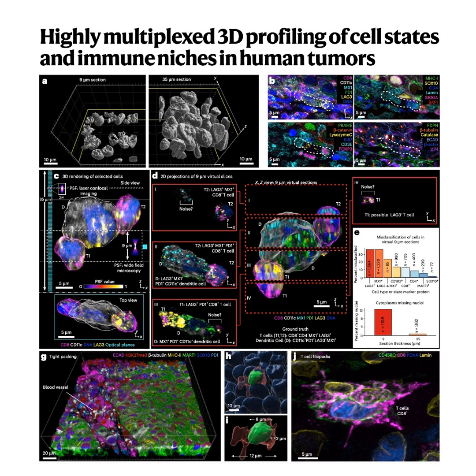70 nanometers, let's put that in perspective again. A human hair is maybe 70,000 nanometers. The old thin slices were 5,000 nanometers. We're talking incredibly close. Exactly. Nanoscale precision. And that 70 nanometer spacing is biologically significant. It's the precise distance consistent with the formation of an immunological synapse. That's the specialized tight junction T cells form when they recognize their target and get activated, right, or deliver a killing blow. It's the critical handshake. Okay, so type I is the direct functional handshake, the synapse, leading to activation, killing, or strong signaling.